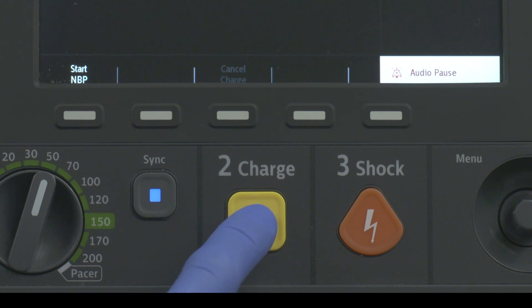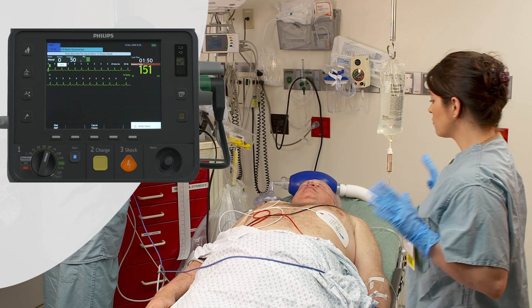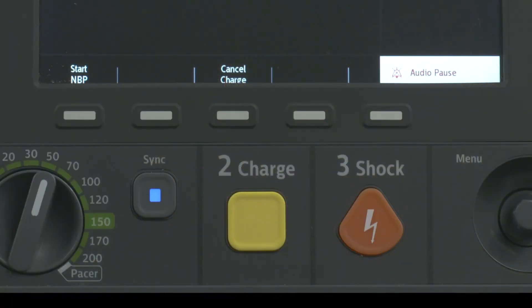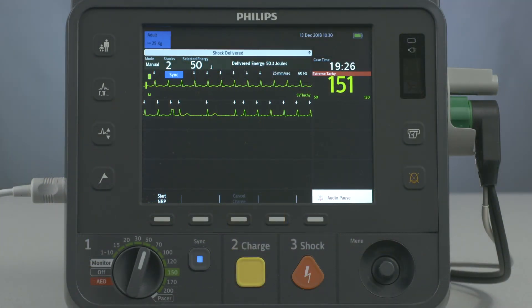Press the Charge button on the HeartStart Intrepid. Make sure no one is touching the patient or anything connected to the patient. Press and hold the Shock button on the HeartStart Intrepid. A shock delivers on the next detected R-wave.